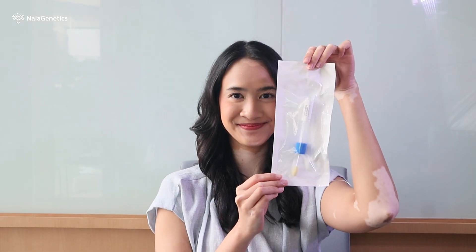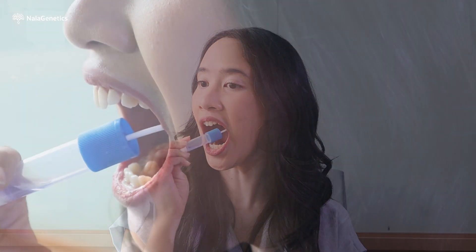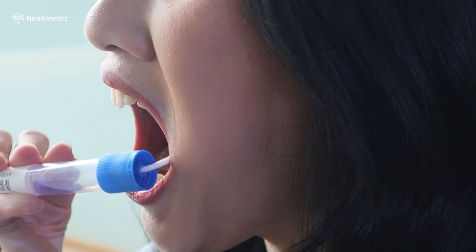Open the buccal swab from the 'open here' sign and take out the buccal swab carefully. Avoid contact with the swab to keep it sterile. Place the buccal swab on the inside of your left cheek. Press the swab firmly to your inner cheek and swab in a back and forth motion with moderate pressure for 30 seconds. Move the swab to your right inner cheek and repeat the same process for 30 seconds.